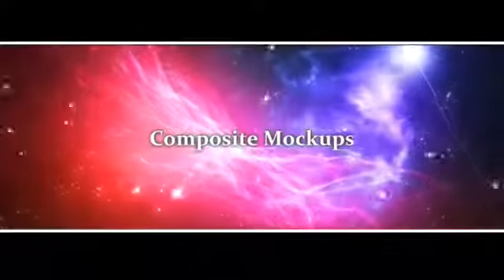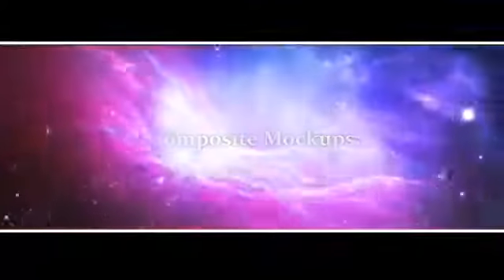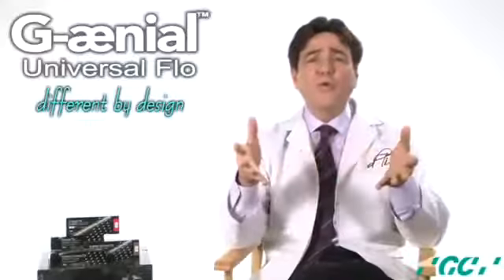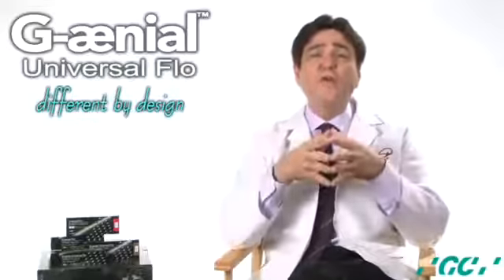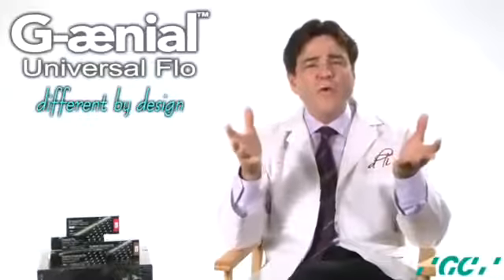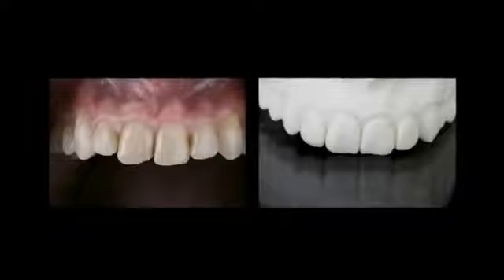For composite mock-ups, the composite mock-up is an excellent tool for increasing the patient's understanding and education of the clinical procedure through a visual prototype. This composite prototype allows the patient and the restorative team to establish parameters for lip profile, incisal edge position and length, and orientation to the gingiva, and to simulate the final result.